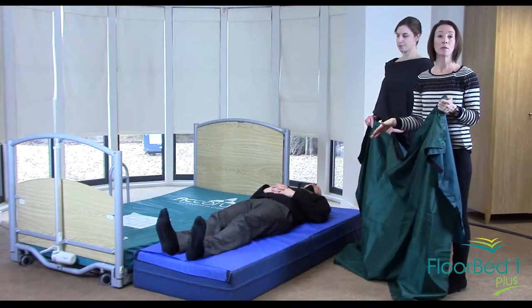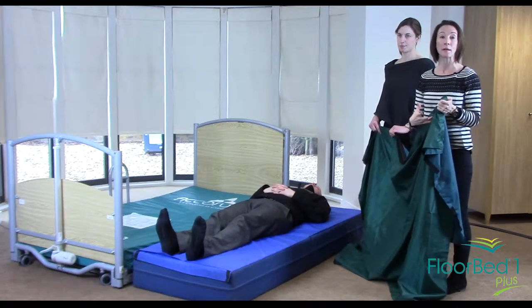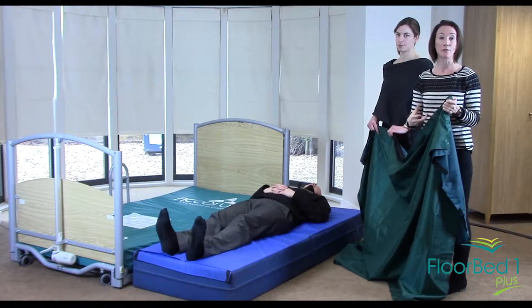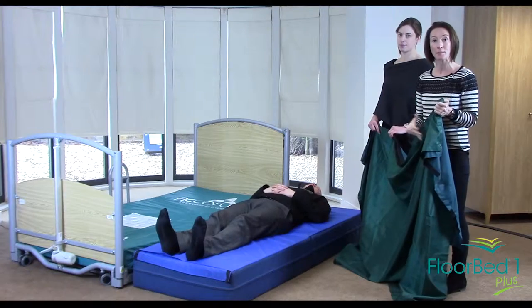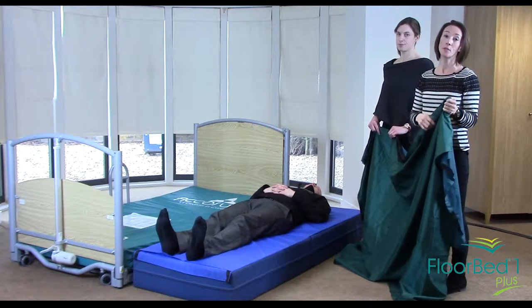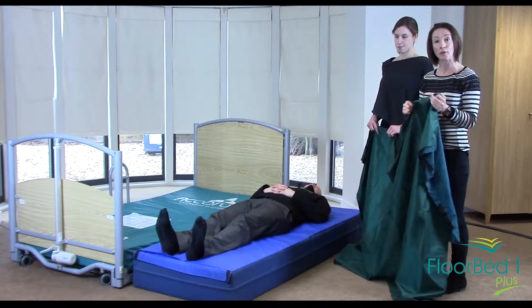A safety mat can be used if someone is frequently falling out of bed to reduce the risk of injury even further and to enable a much easier and quicker method of transfer back into bed. This can be less time consuming and easier than using a hoist or an elk lifting system.